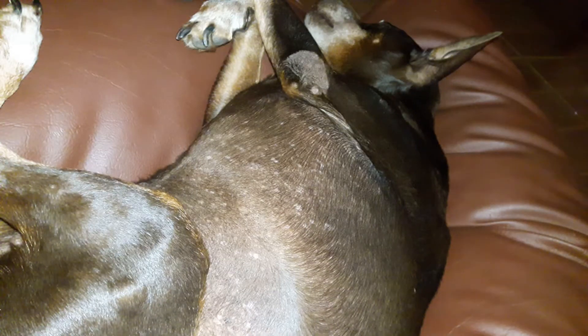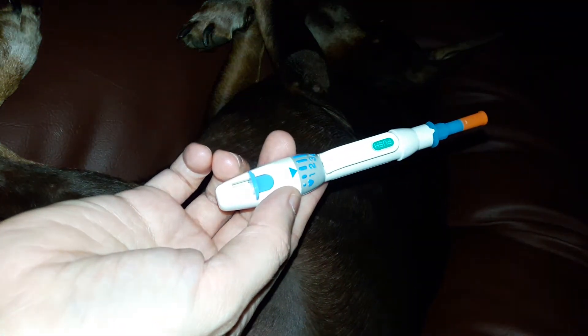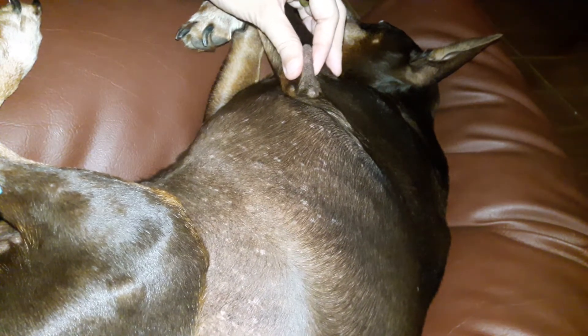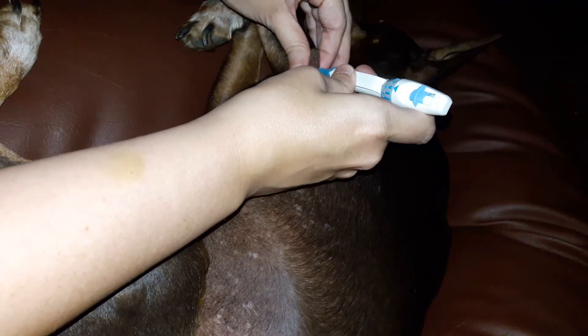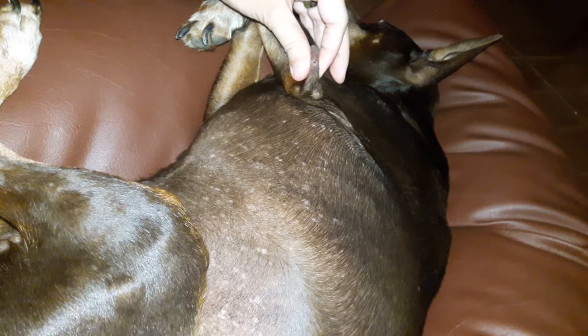We're going to test Harry's blood sugar and blood glucose level. I've got the lancing device set on two, which is what we use. I'm going to take the cap off now and find a nice part on his elbow callus that is a little bit thinner, then just press the device against it and press down. You can see he doesn't feel it — he's totally asleep.